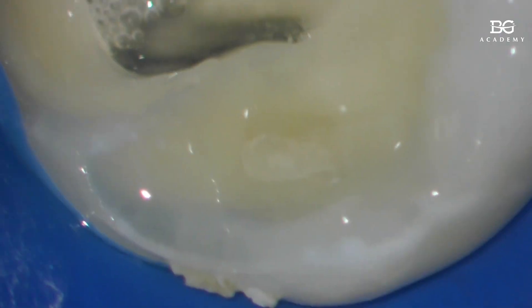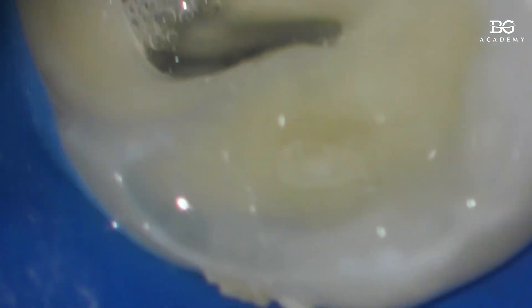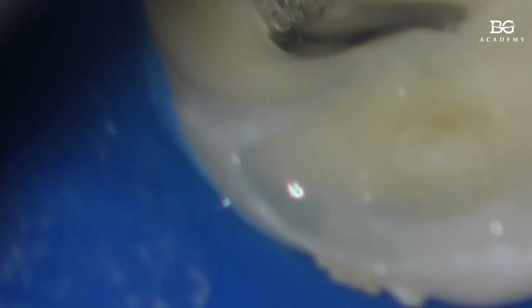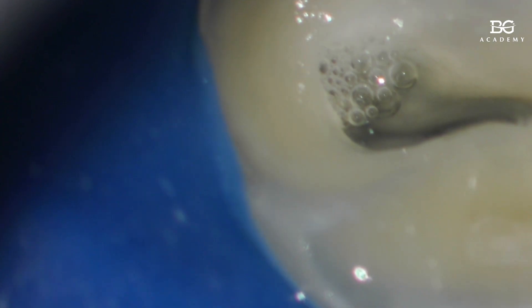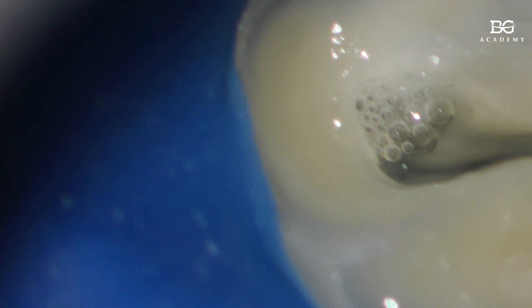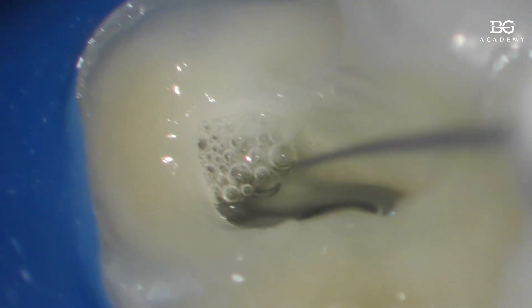Next, in principle, we can try to determine the working length and check it with the apex locator. We started working and tried to determine the working length but couldn't — we didn't reach it. What would you do next? You can use a hand file, or you can take the rotary ProGlider — the white one — and set it 1 millimeter shorter. How much do we have? It was 17, so set it to 16. I think I already went into 18, to be honest. Let's set it to 16.